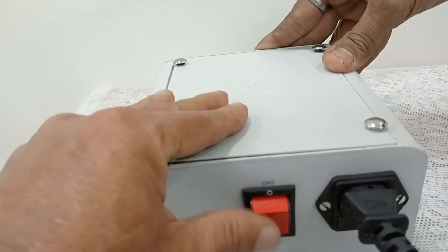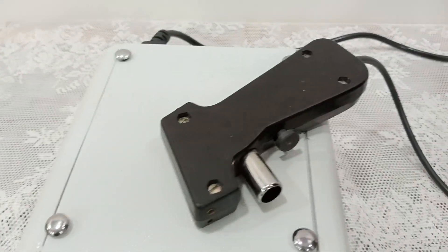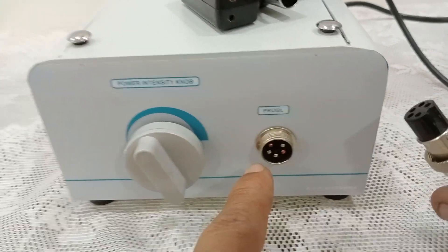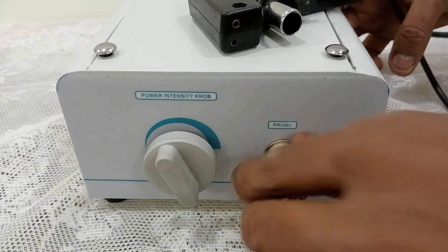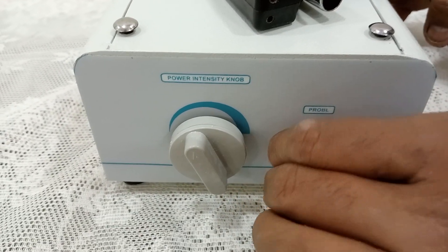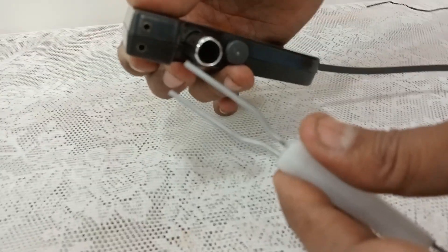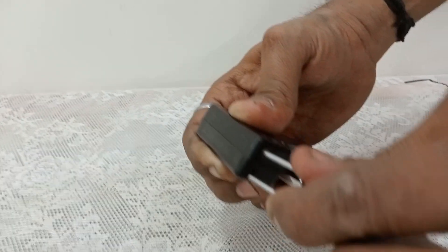You have to put the machine on. This is the probe and this is the connector with the female holes. You have to connect it exactly at the port provided. In the probe you will find two holes, and the male pin has to be inserted into the probe. This is the hand probe, which is the pistol handle.